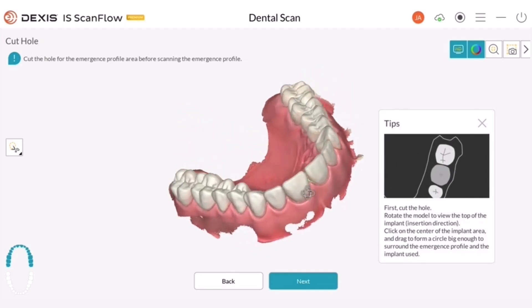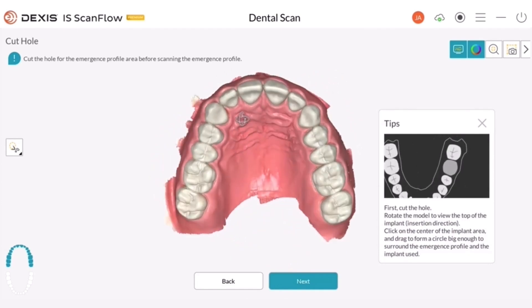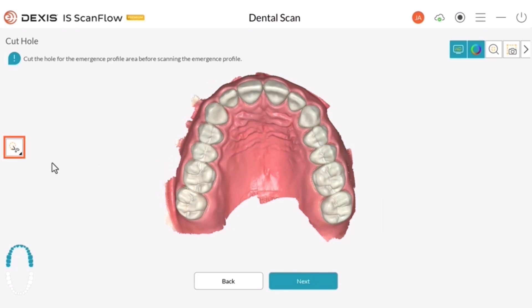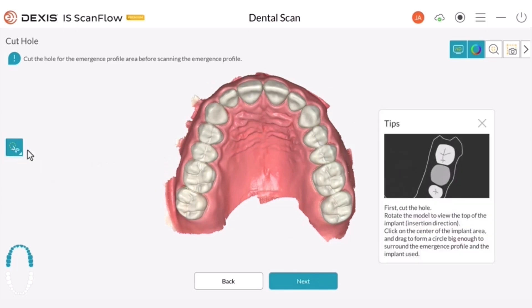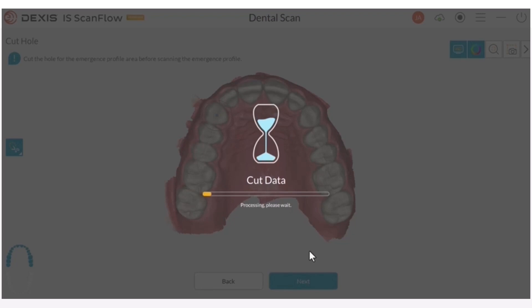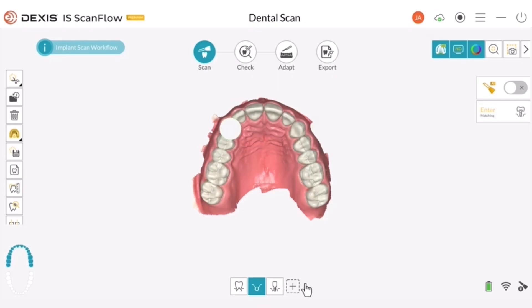Rotate the model to view the top of the implant. Click the cut icon. Draw a circle big enough to surround the emergence profile. Click Next. Remove the temporary or healing cap, and then scan the emergence profile.